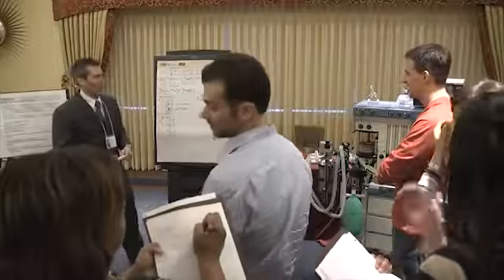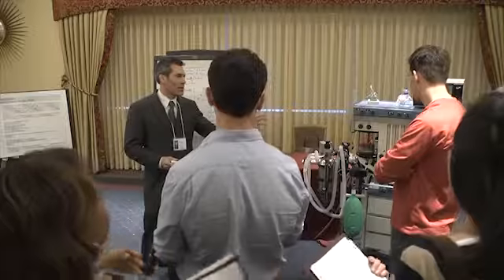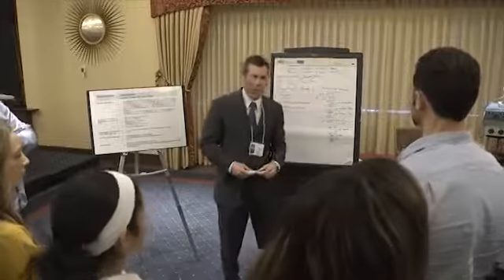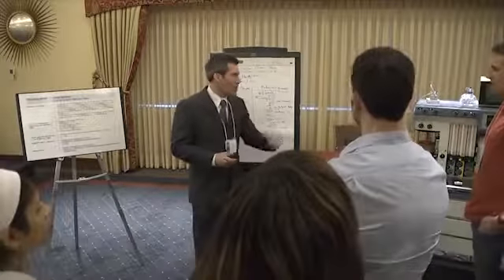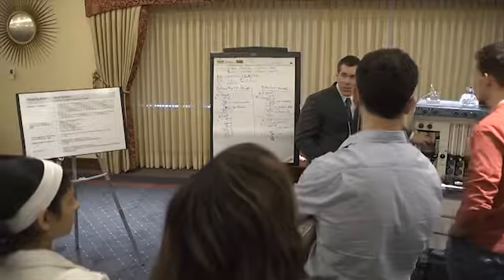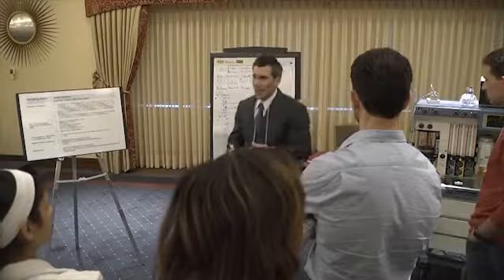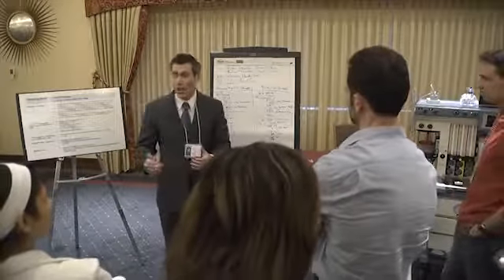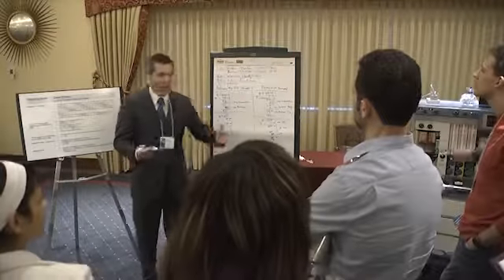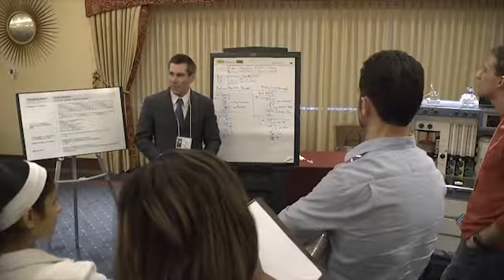But Dave eloquently explained the difference between the bellows non-fresh gas flow decoupled machine and the piston-driven fresh gas flow decoupled machine. Now that you went to a piston-driven system, you no longer have a bellows, which was the de facto reservoir for your patient. We now use the manual ventilation bag as your new reservoir, so that's where the fresh gas flow gets decoupled. So why did we transition this Draeger machine to the piston-driven fresh gas flow decoupled kind?